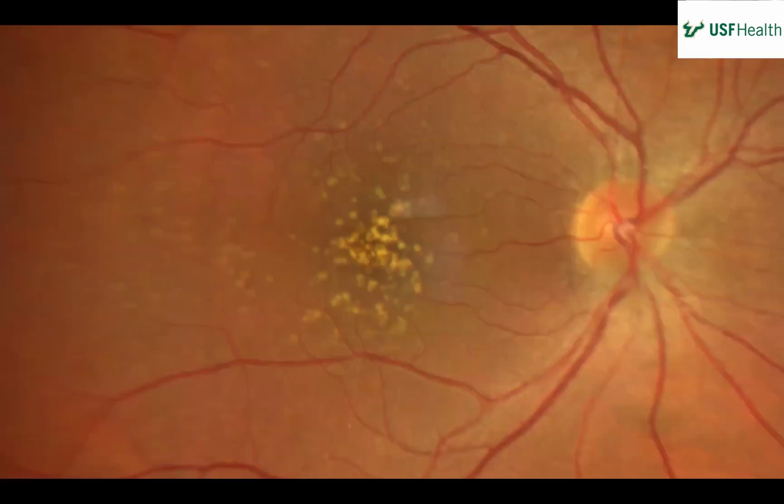So, go ahead and see the fundus. Okay, this is a fundus photo of the right eye. Media is clear. The nerve looks pretty pink and sharp. Vessels look pretty normal. Your attention is drawn to the macula where you see multiple hypopigmented, almost cholesterol-appearing, yellow stippled lesions, mostly in the macula, but there are a few extending temporally and superiorly.